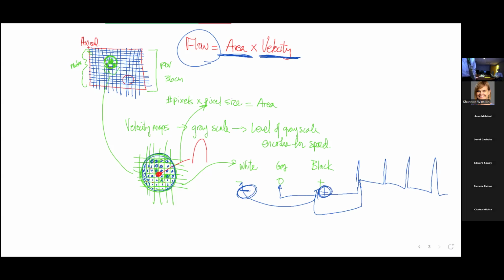You put those two together, and then you get the velocity in this area, what's moving, and we're going to talk about the different planes in just a second. And we'll assume this is through plane flow in and out of this whiteboard. And so very nicely, you can measure the blood flow and the velocity.